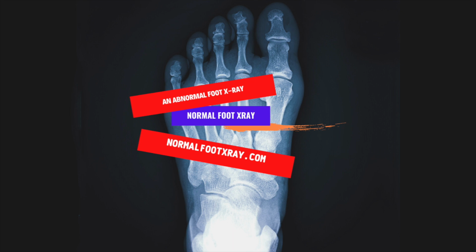However, a foot X-ray may also identify tumors or cysts, which are not visible without a doctor's examination. An X-ray image of the foot is one of the most important investigations in orthopedics. It can reveal a number of problems, from broken bones to dislocated joints.